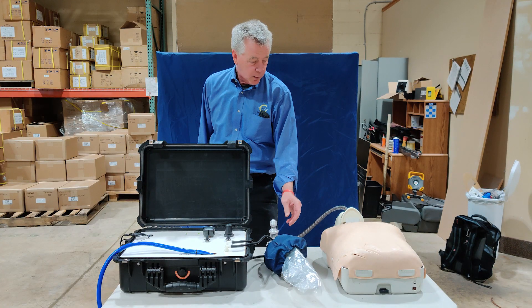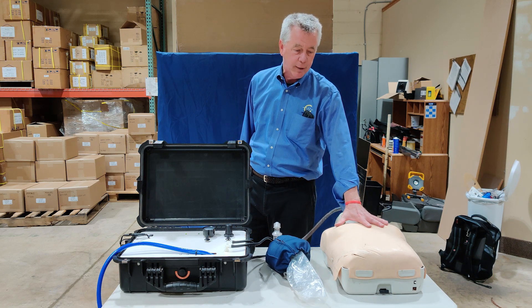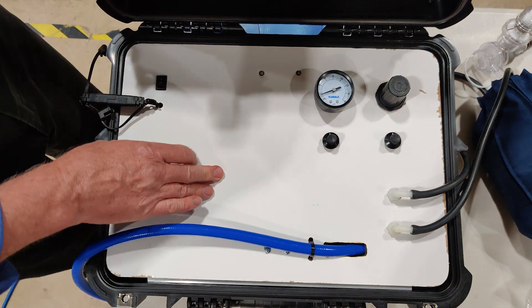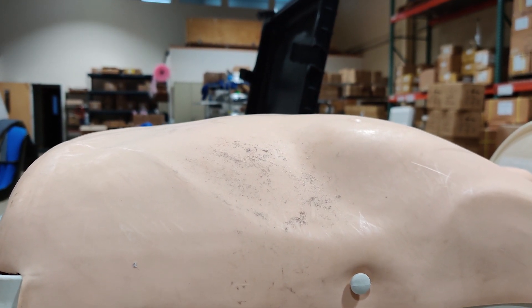We are tying it right now to a resuscitation training dummy to show the operation. We have the ability to adjust the amount of time or the amount of volume of air that is coming into the chest, and also the breaths per minute.